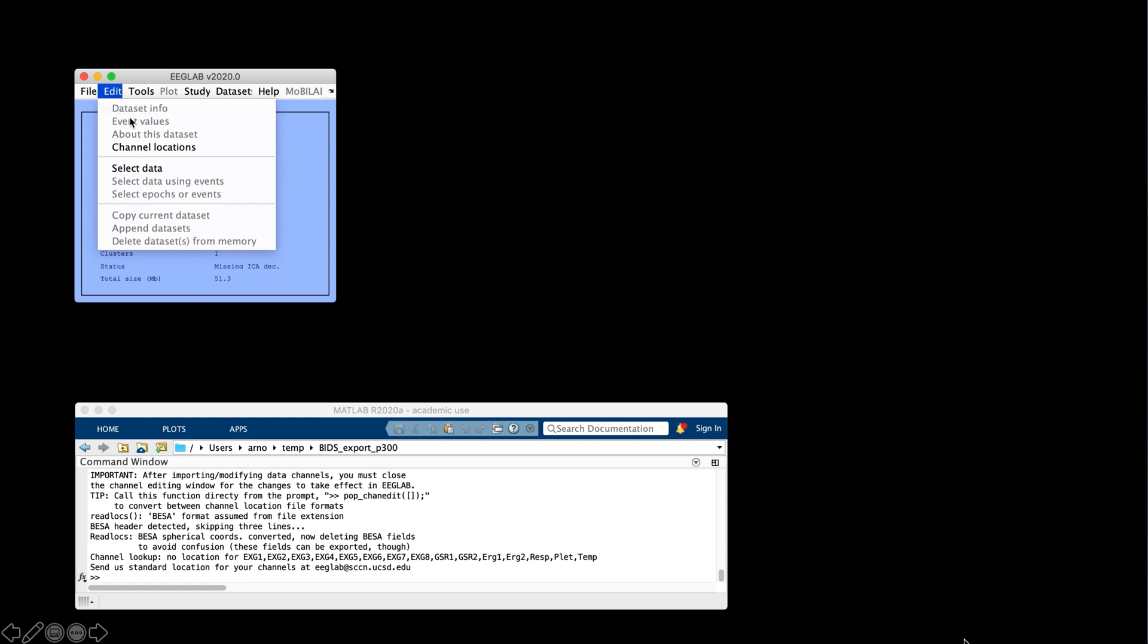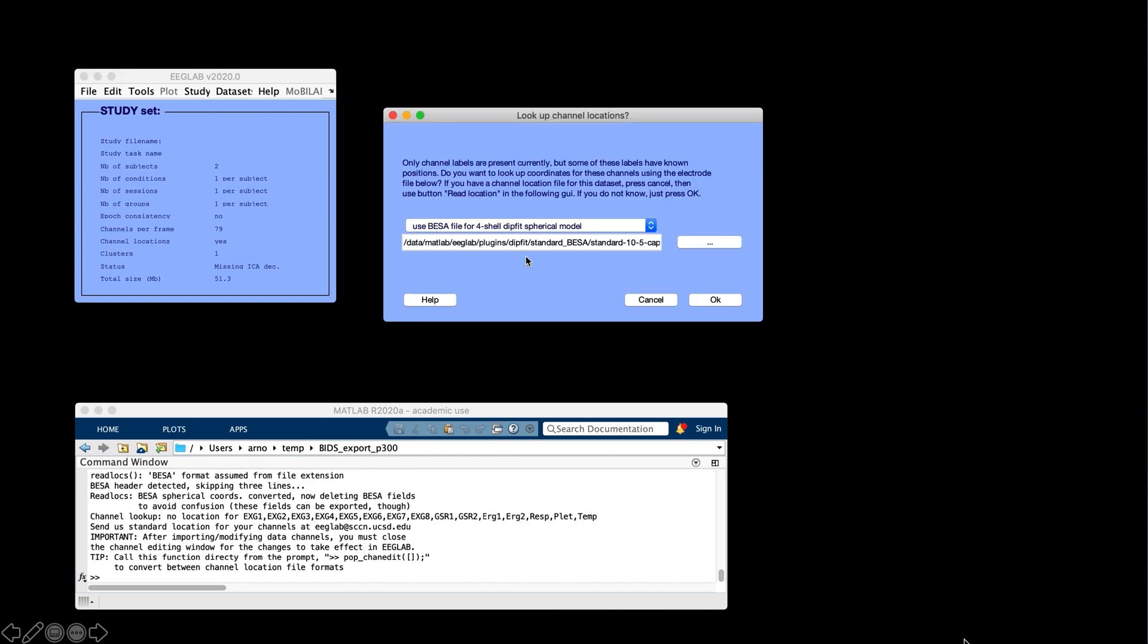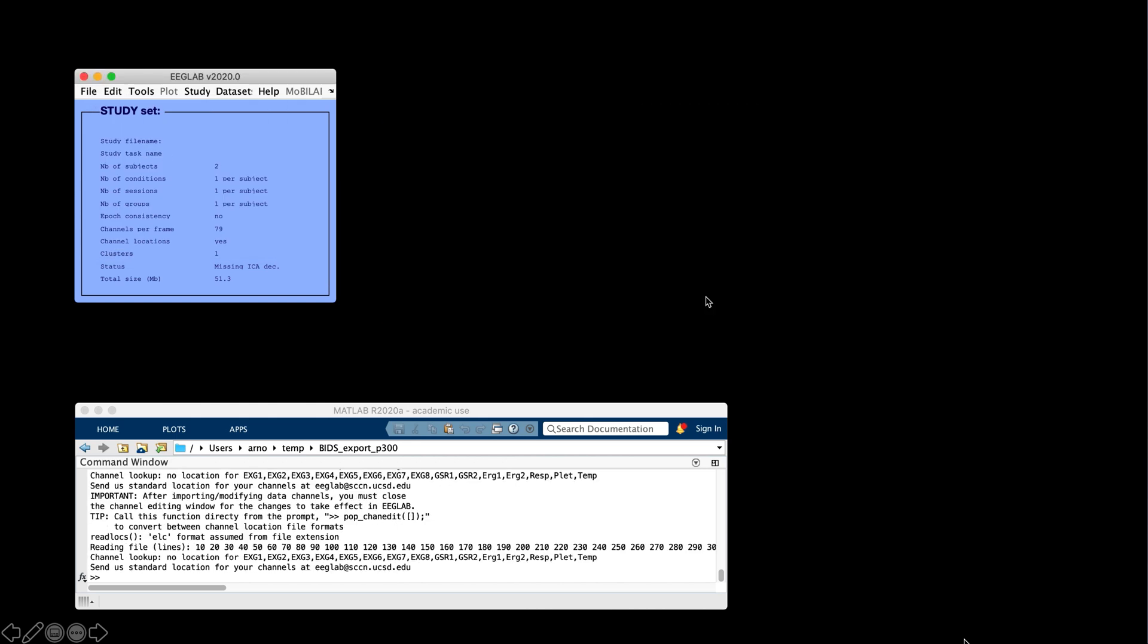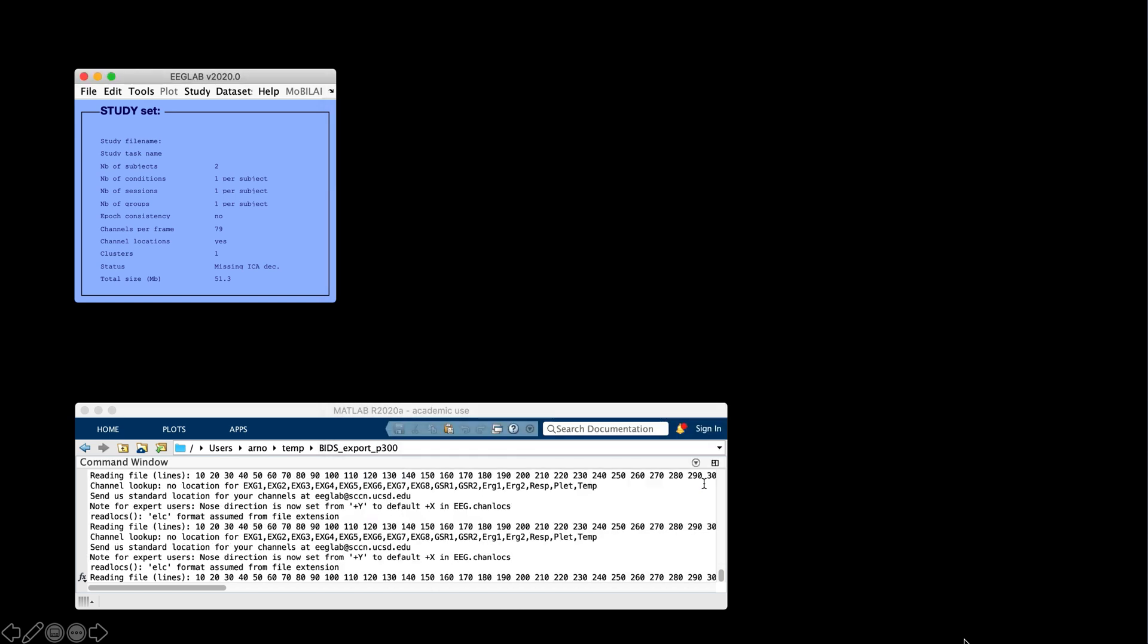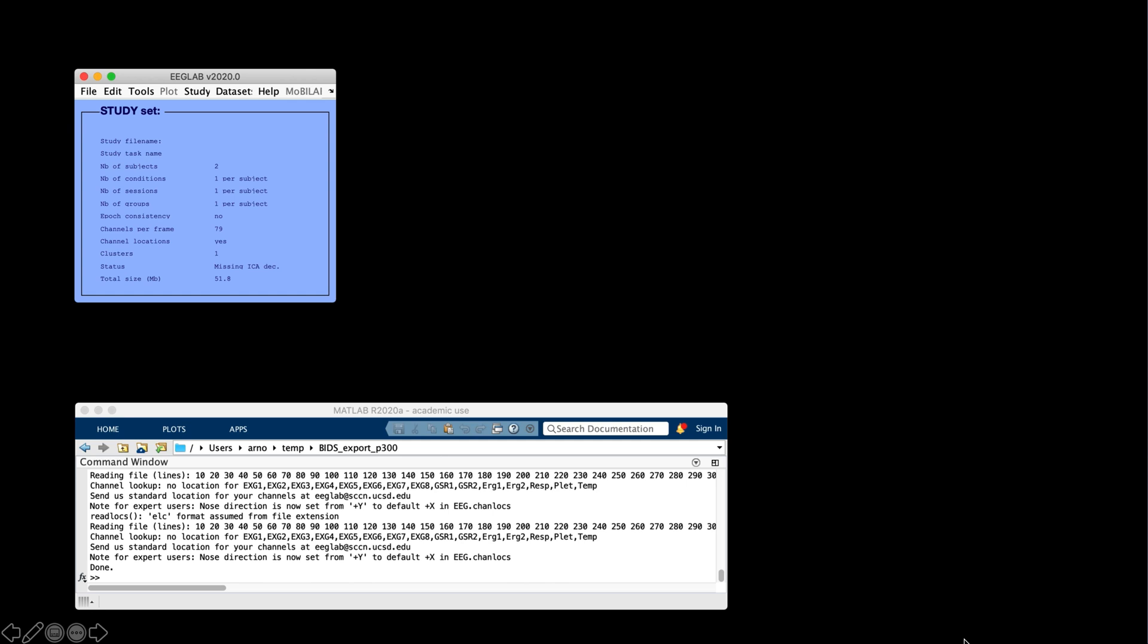Before we enter BIDS information, let's assign locations to our electrodes. In the raw data files, channel locations are often not available. In EEGLAB, we can simply use the channel location menu item, and based on the channel labels, it will automatically use template locations. There are several choices for the template. Here, I'm using the template BEM channel location, which are usually preferred compared to the default spherical channel coordinates. We'll simply change the default in the near future. Channel locations will be exported along with the BIDS dataset. Researchers who import your data will already have electrode locations for your datasets.